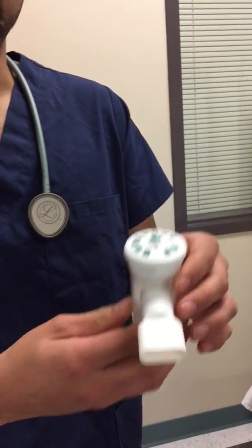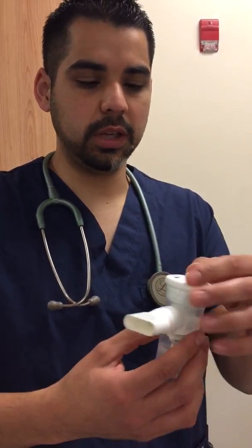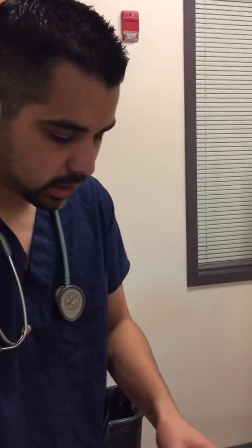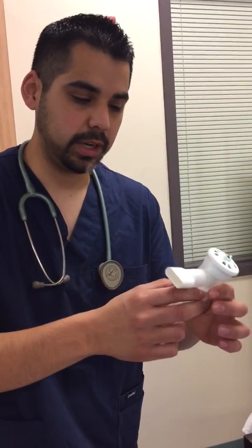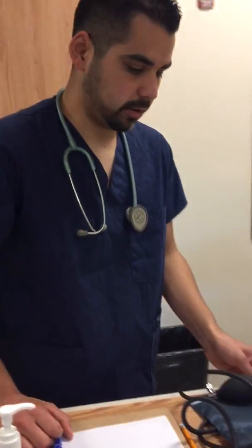So we're going to set it to continuous nebulization, because if the patient doesn't have a good inspiratory effort, he can slowly breathe in and out through this, and I'll be explaining to him how to do that. I just want to note in the video that that's how this works, and here we go. Also, I have my drug. I will be pretending that I'm putting the drug into the device, and I'll note what you will see when that happens. Okay? So now I'm gonna gather my things, and I'm gonna go inside.